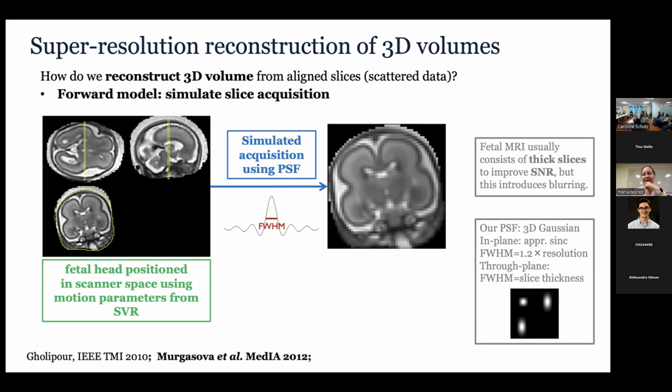So we're not really using it that much because we continue with our CPU implementation, but it's more accurate if we do that. So this is just approximately with the Gaussian. I mean, it's possible to do. I think it's good to maybe think about doing it a bit better. We could have a truncated sinc potentially. That would work a bit better. But this is what we have at the moment.